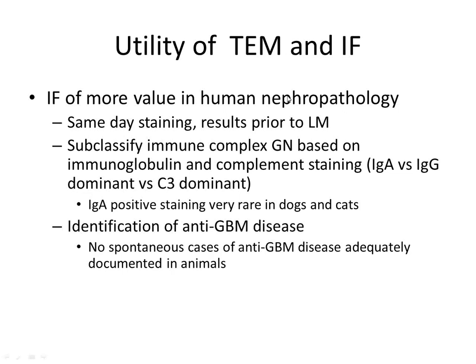But the other reason it's really important in human nephropathology is that they have a lot of very specific dominant phenotypes. So they have an IgA dominant immune complex mediated disease. They have an IgG dominant immune complex mediated disease. They have a C3 dominant immune complex mediated disease. We've seen IgG. There have been reports in the literature of C3 dominant glomerulonephritis in dogs, and there is a report, I think, out of Korea or Japan of IgA dominant glomerulonephritis in dogs. At the IVRPS, International Renal Veterinary Pathology Service, we haven't seen these phenotypes, but that doesn't mean they don't exist. It's just we haven't seen them yet.